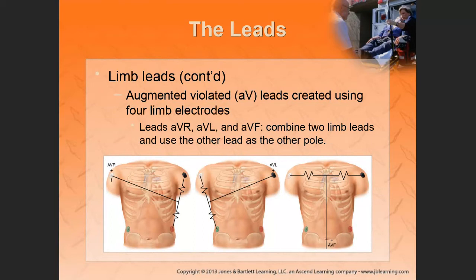So we can now see the right side. Cool. For AVL, so AVR right, AVL left, AVF inferior or foot. So it's inferior.